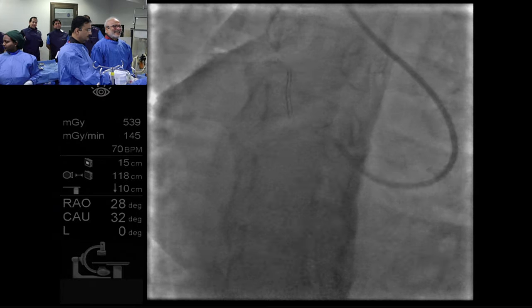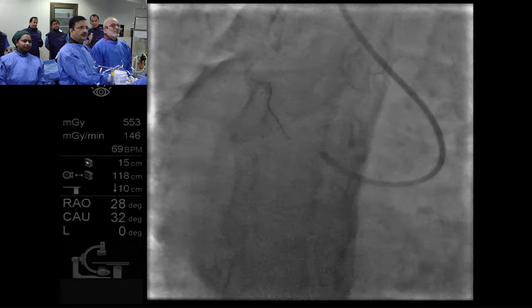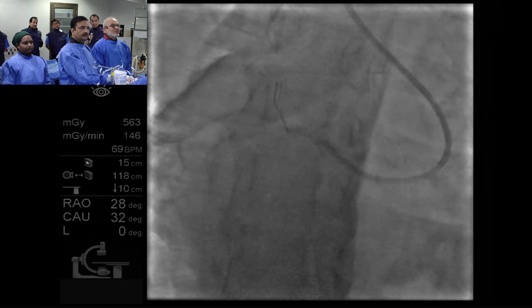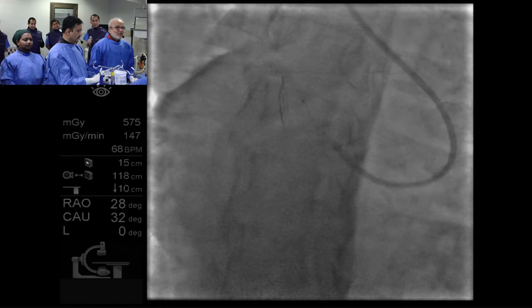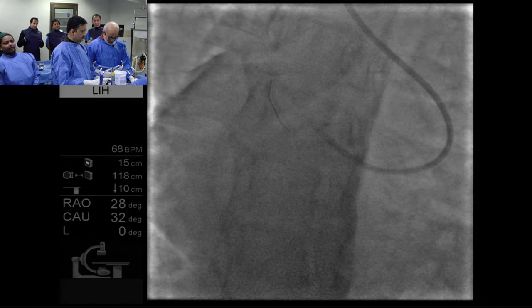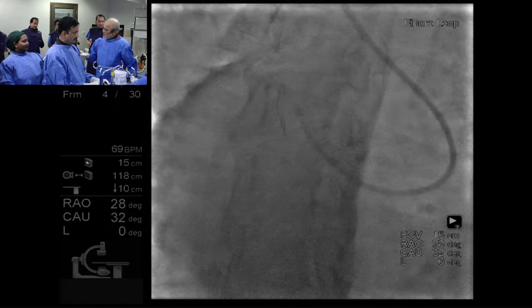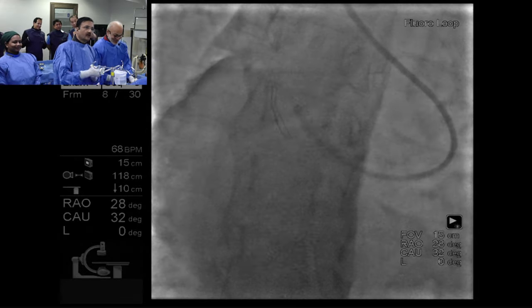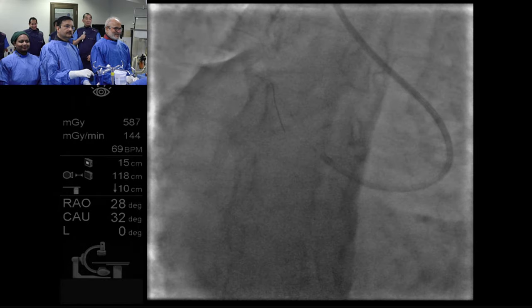Right, so now you're going to OCT? Now I'm dilating with a bigger balloon. What balloon? It has still not reached. Yes, 2.5 by 15 NC Track Neo. Okay, fine, go. Guaranteed, there is no nodule. 99%, I cannot guarantee 100%. Because it opened well? Yes, very quickly it opened.